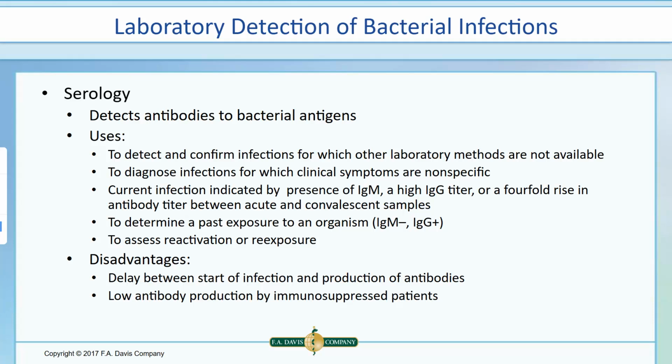Another disadvantage that I'd like to throw in here is that sometimes we can't tell if a patient has an active infection or a previous infection. Now, we can sometimes distinguish the IgMs versus the IgGs, but sometimes having a lot of IgGs could indicate a current active infection, or it could indicate previous exposure, so sometimes it's hard to tell the difference.